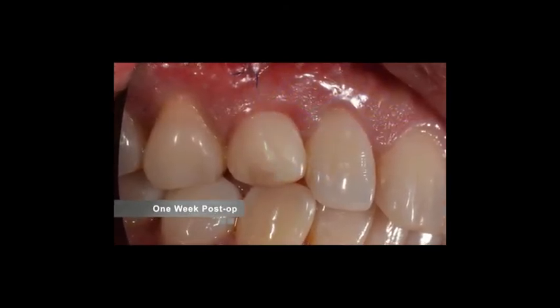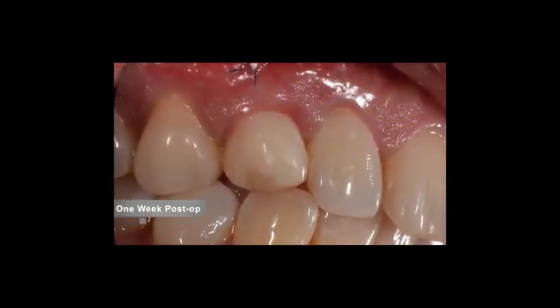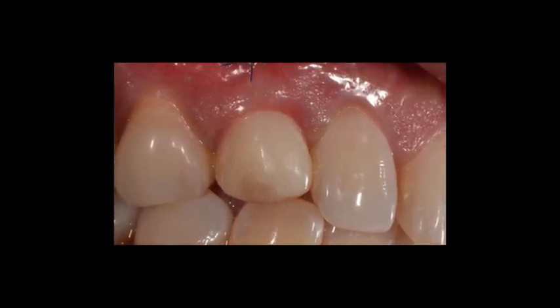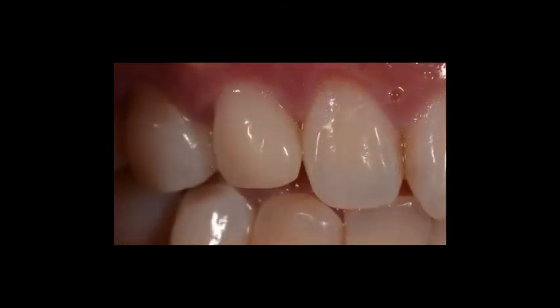This is a 1-week post-op. You can see here that the incision apically heals up very well. Typically we remove the sutures at 2 weeks. I really don't see the patients before 2 weeks.